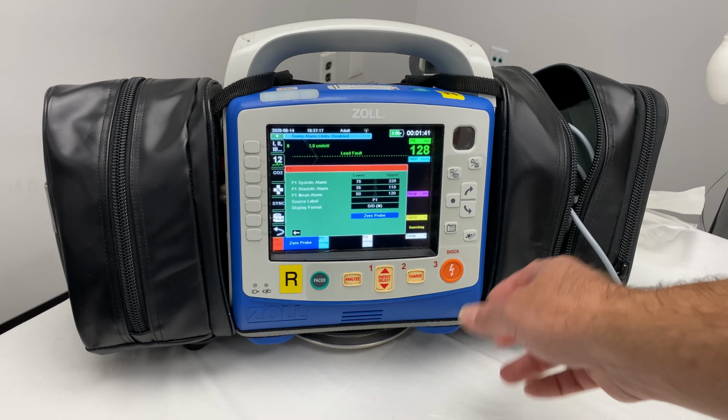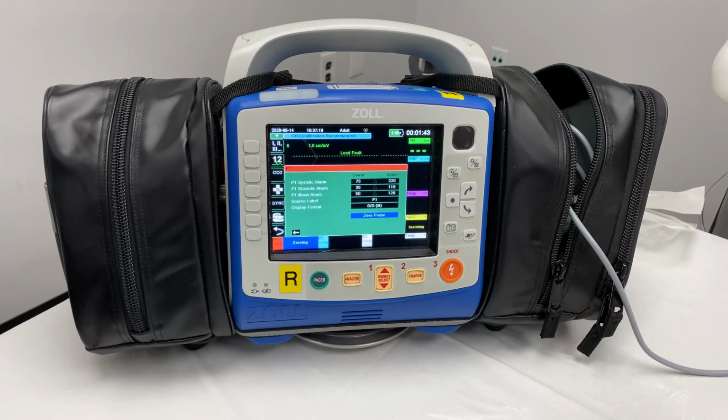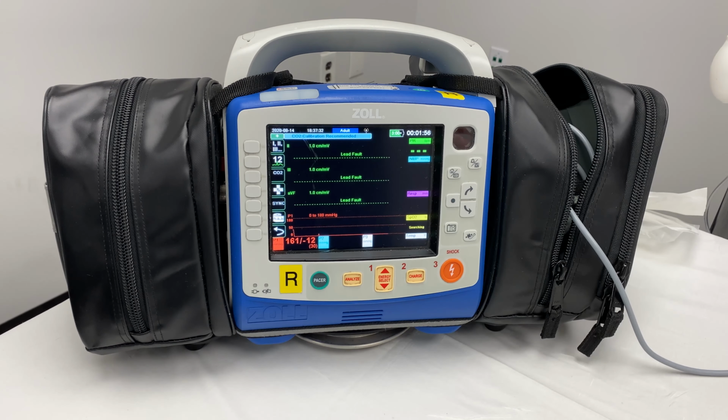The cap stays off. We'll zero the probe. Then you can see it says zeroing, and now it's zeroed. Now we can put the cap back on, go off to atmospheric pressure, and go back to the main menu. That's it.